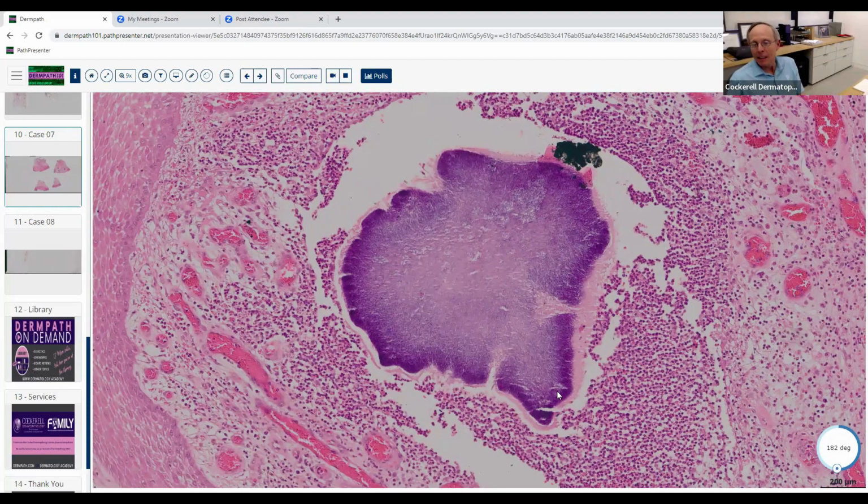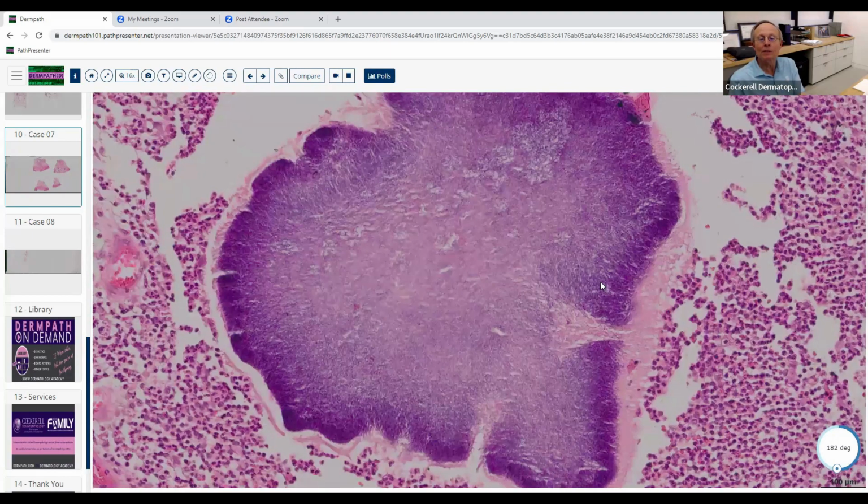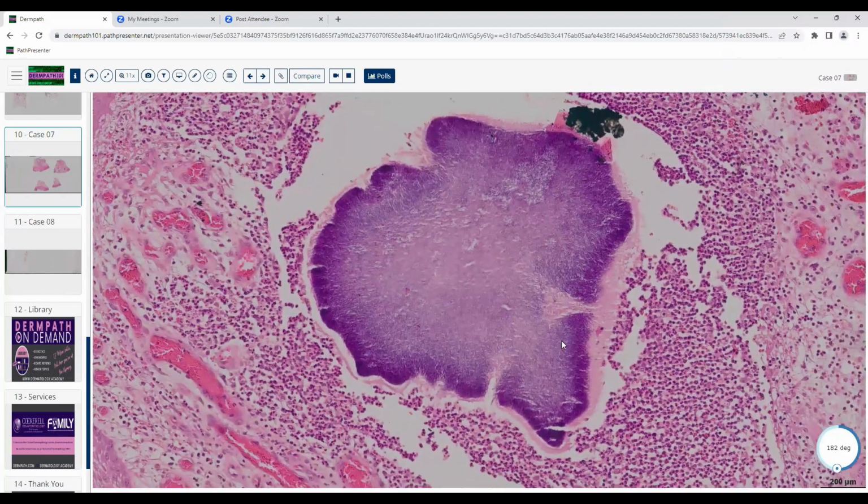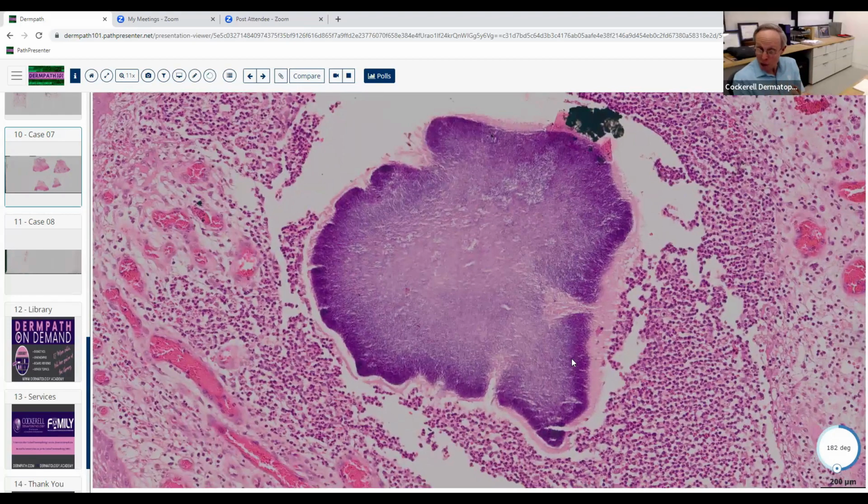It's a grain. So when you see grains formed in the skin, they're usually due to bacteria or some other kind of organism. And you can get grains in botryomycosis. What are a few other conditions where you can get grains in the skin caused by infectious agents? I would bone up on this because they may well ask you this. Eumycetoma. Yes, fungi, fungal grains.